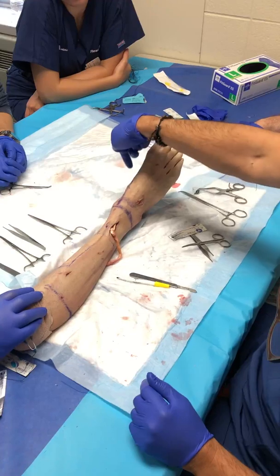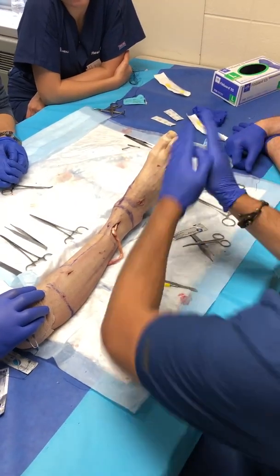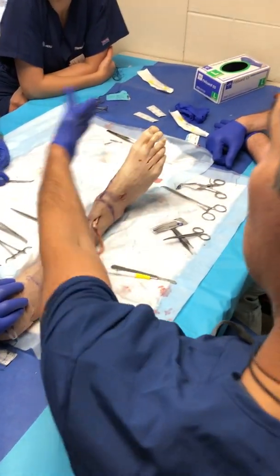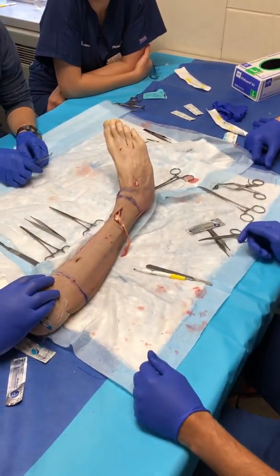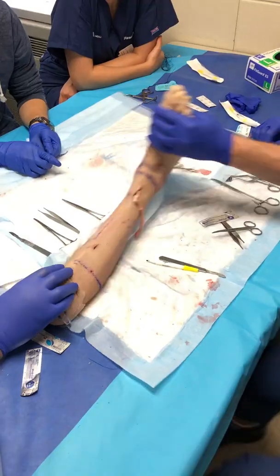Now, when it's split, you cut the lateral side of it, or the more dorsolateral, keep the medial attachment, you pull it up here, and now you put it right here. Okay, go ahead. You guys continue.